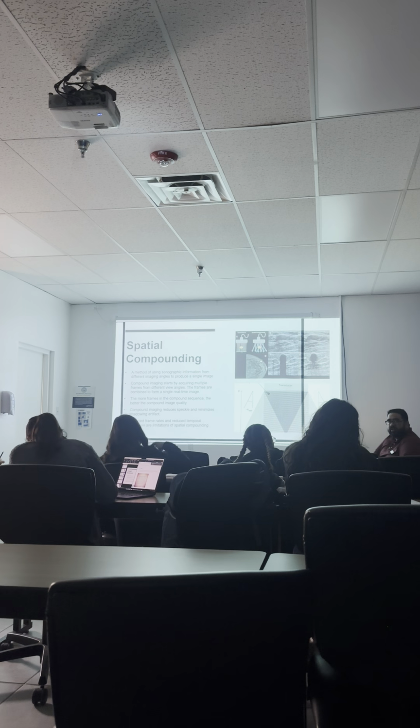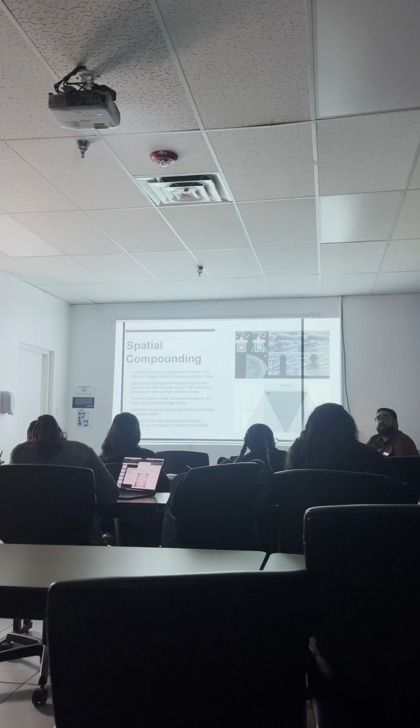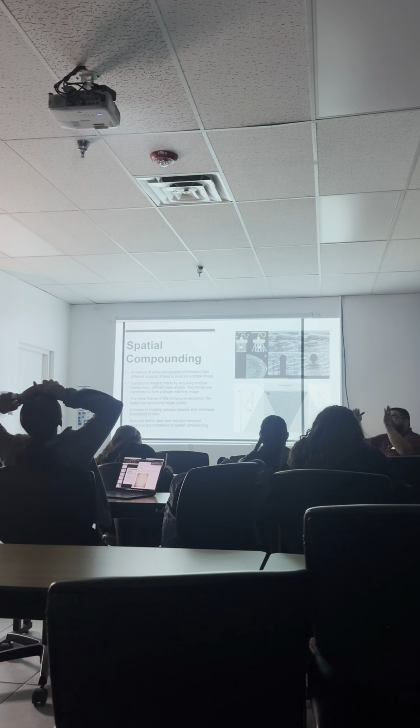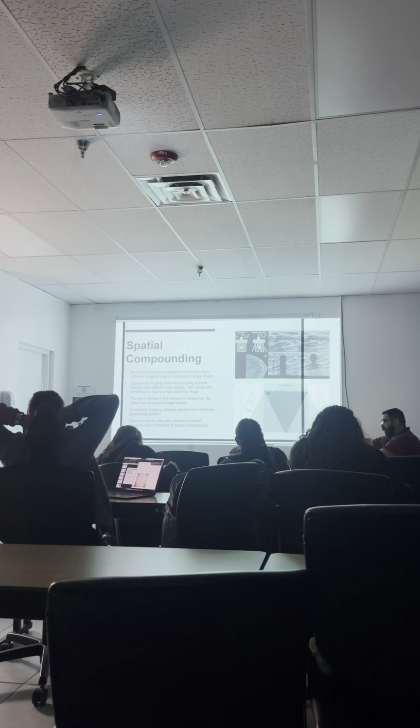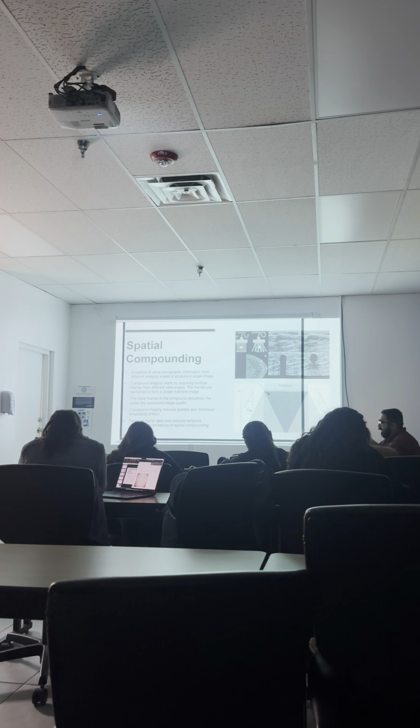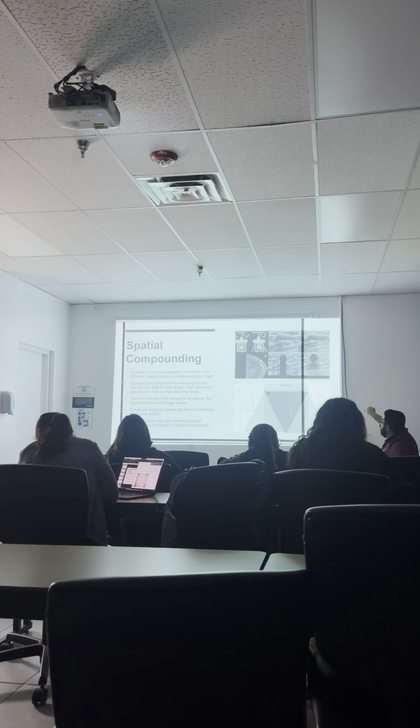Right, beam steering. Okay, and how do we achieve beam steering? Electronically, through what component? The beamformer? The beamformer, yes. By the beamformer, okay? So the probe will send out the steered beam to the right, to the left, down the middle, and put those images together to make a clear, detailed image, okay?